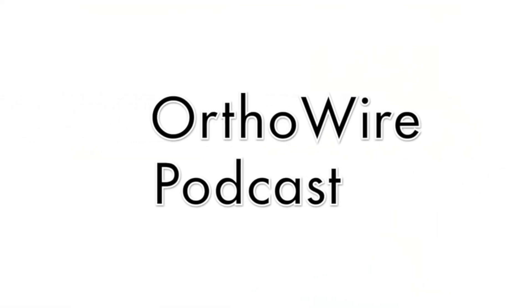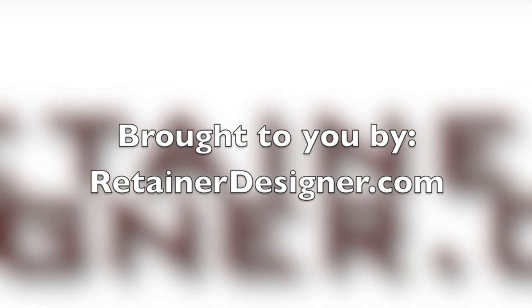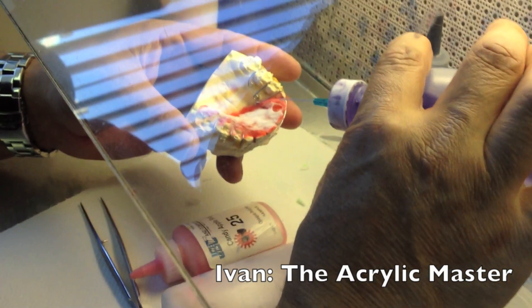Hello guys and gals, welcome to another episode of the Ortho Wire Podcast. Today we're going to be updating a video of the zebra retainer pattern — the one-step design that I taught Ivan how to do and he's perfected. Let me show you what he can do — watch Ivan the master at work.